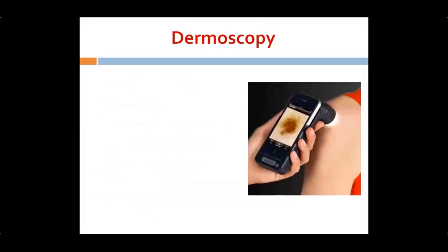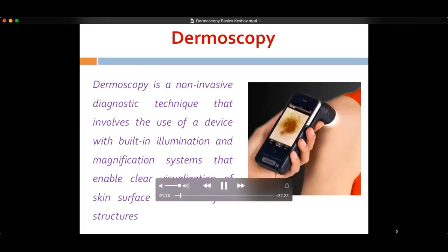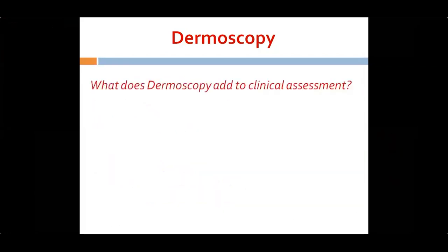So dermoscopy is basically a diagnostic non-invasive imaging technique that provides us with a basic advantage of being able to see certain things in the skin lesion that are not amenable to the naked eye or even with a magnifying lens. So basically, dermoscopy adds an edge to the clinical assessment protocol.